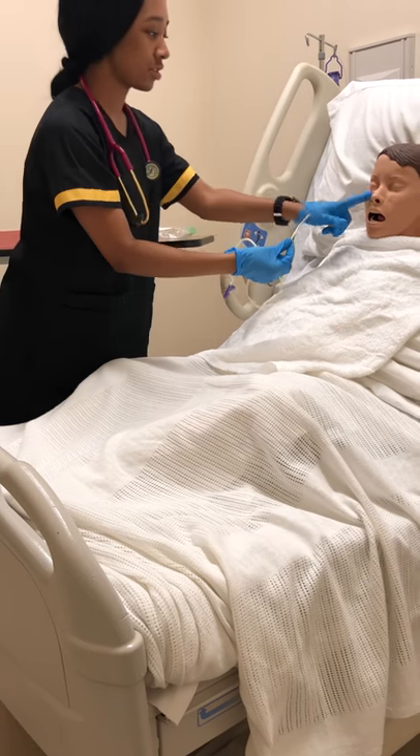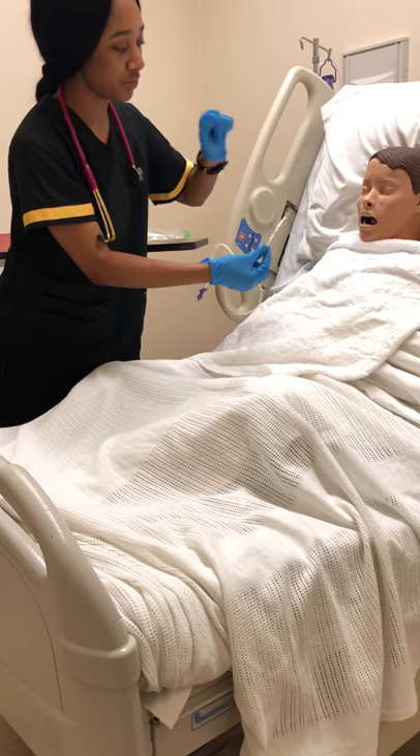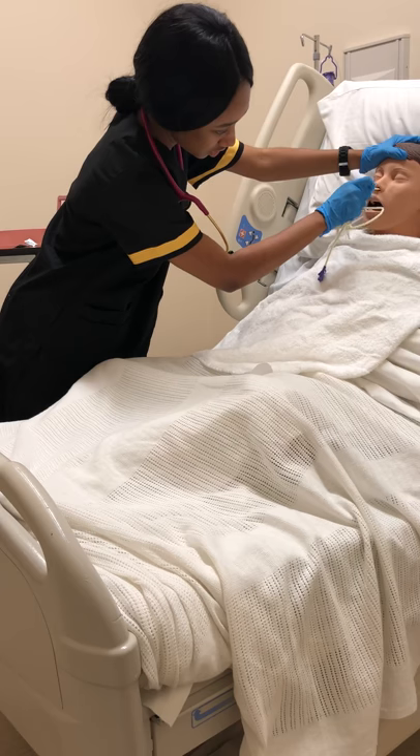All right, can you breathe out of this nostril for me, and now the other one. So which one would you like to have it inserted in? This one? Okay, so we're just going to begin. I just need you to hold your head back. I'm just going to insert it.